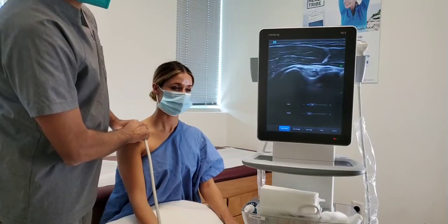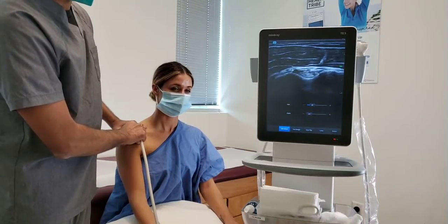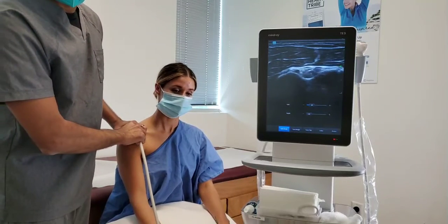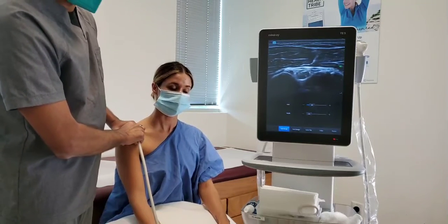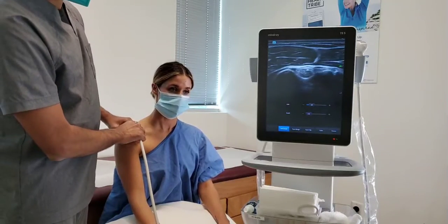Other things we can see is if there's fluid surrounding the tendon. The fluid surrounding a tendon could be a sign that there's inflammation of the tendon itself, or it could be a sign that there's inflammation coming from within the shoulder joint, because as I mentioned, the tendon is continuous with the inside of the shoulder.